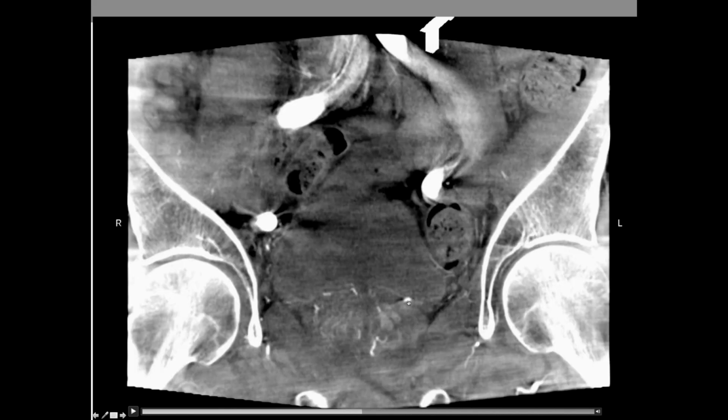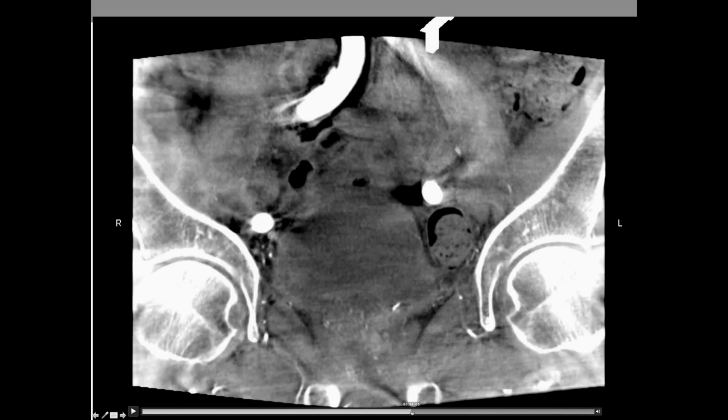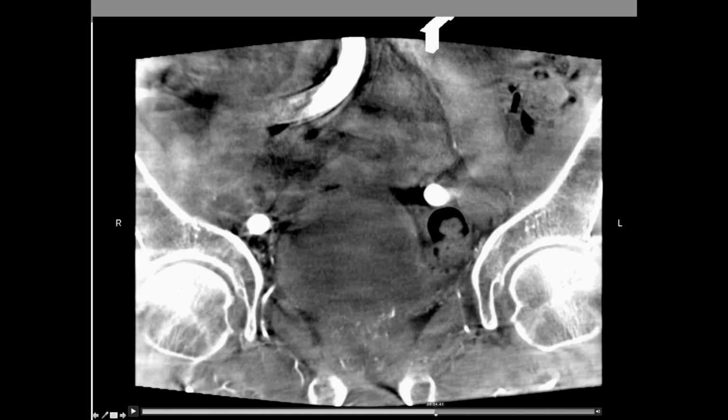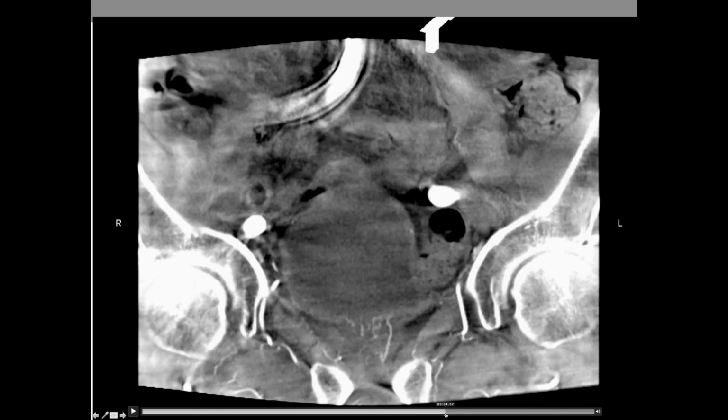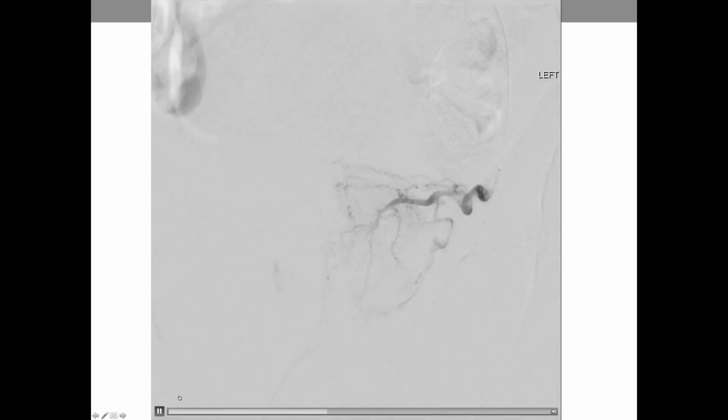Okay, so right here, there's this big vessel that's coming into the prostate, and when you have arteries that big coming into the prostate, they're clearly anastomoses because they shouldn't be that big at that stage of the prostate. There it is, right there, and you can see it nicely coming down. And this is the anterior portion. The penis is down here, so it's likely attaching to another artery here or anastomosing with another artery here, and getting flow that way.